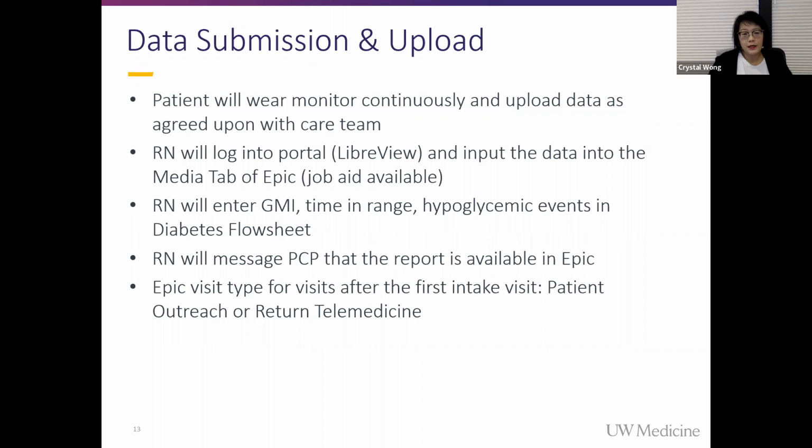I'll show you that in the next slide. And so this is nice because then you don't necessarily have to look back at chart notes or look at AGP reports that are scanned into the chart. And you can look at this over time. So it's in the flow sheets section of the chart.